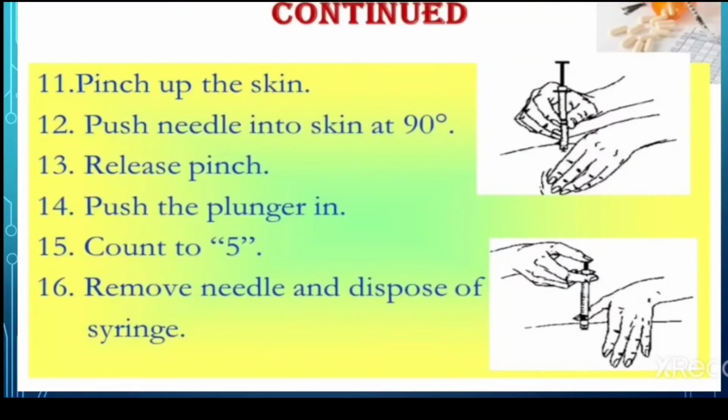and pinch up the skin and push the needle into the skin at 90 degrees, release the pinch, push the plunger in and count to 5, then remove the needle and dispose of the syringe.